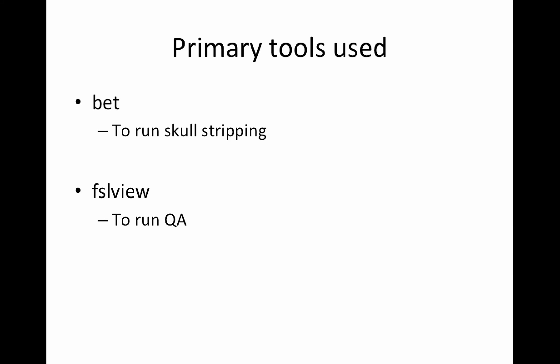But we'll get there — let's just worry about removing the skull and the eyeballs today. The primary tools you'll use are BET, the Brain Extraction Tool of FSL, and FSLview to run the QA. I highly recommend that for a couple of subjects you play around and find the BET settings that work really well. If you're using the same image acquisition for all your structurals, it should work pretty well for most of your subjects.